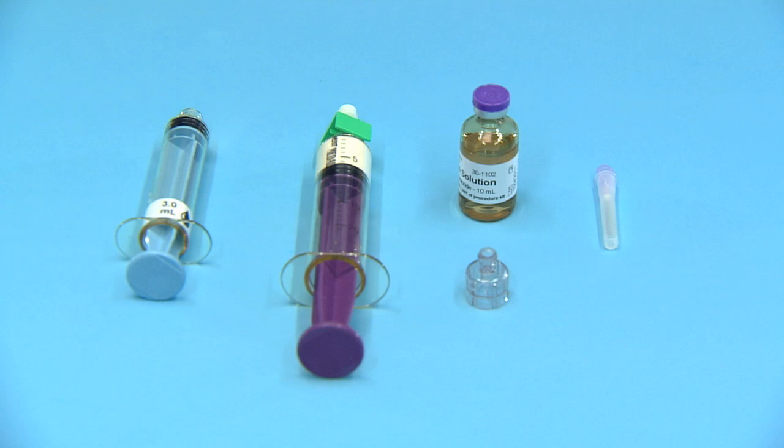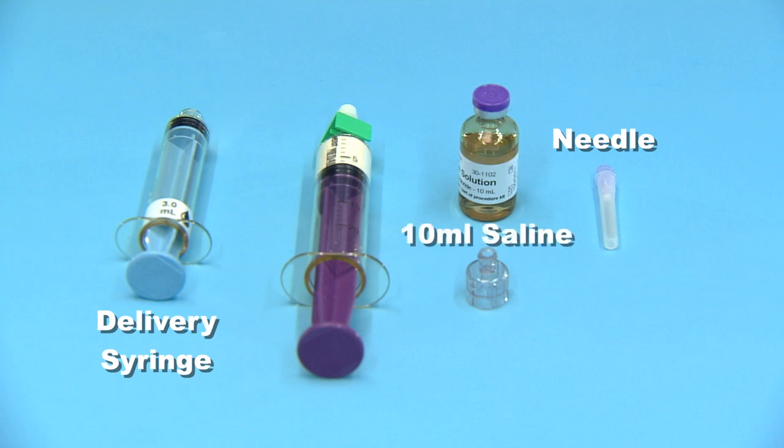The Beta-BSM kit contains the following: one delivery syringe, one needle, one 10-milliliter vial of saline, and one syringe containing Beta-BSM powder.